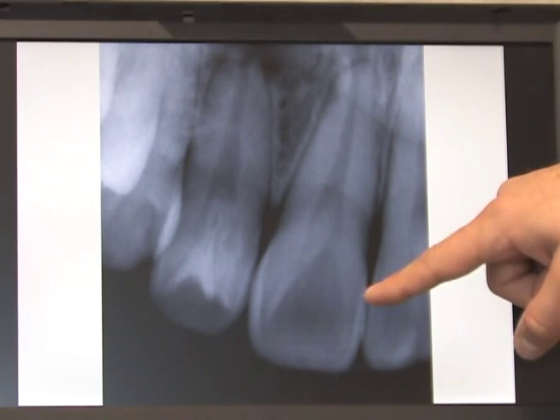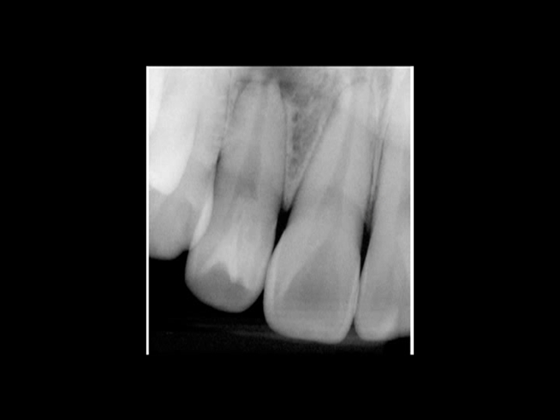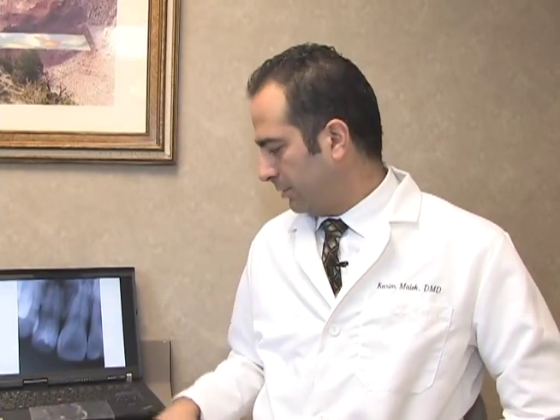If you take a closer look, it looks like maybe there's actually two of them right here. This makes it a bit of an interesting tooth to deal with. We have to make sure all of this is cleaned out, get rid of all the bacteria, and get him back in healing mode.